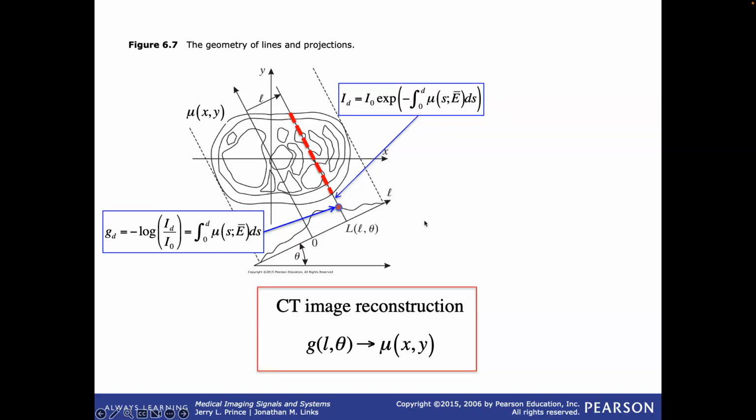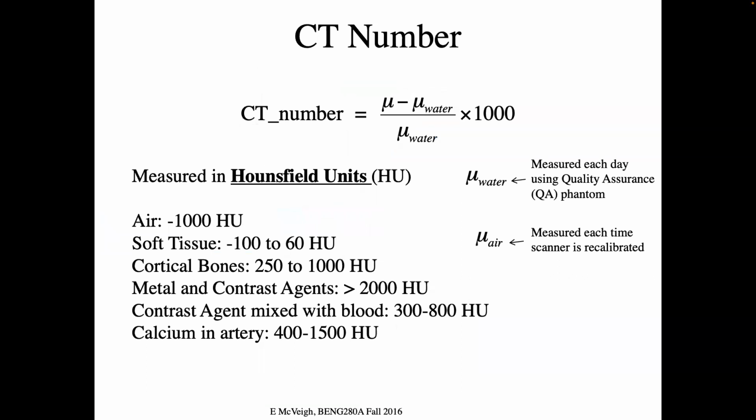When you make this picture, which is basically the attenuation coefficient as a function of X and Y, historically, this was done in the 70s, right? The first ones were done in the 70s. So you have a computer in the 70s, what's it got, 8 bits, if that, right? So they had to take these numbers. They couldn't put floating point numbers up there.